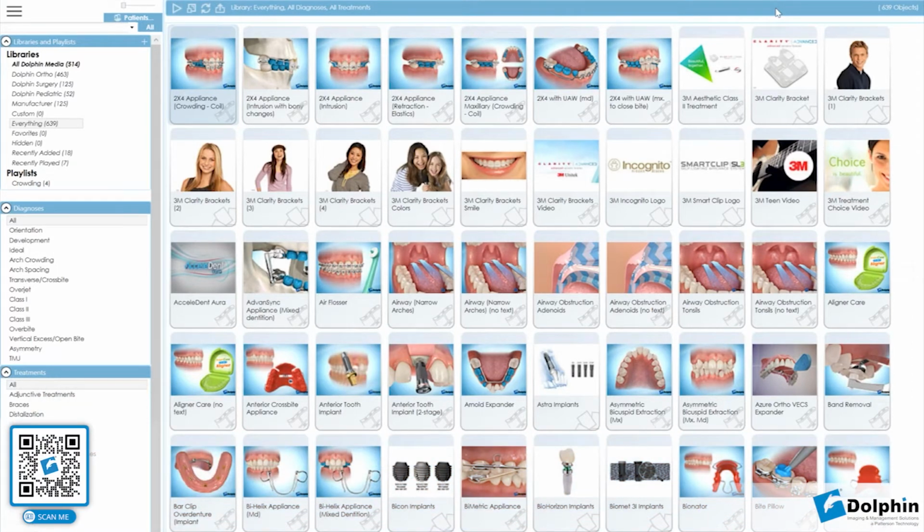And today we're going to be doing a little demo / lunch and learn on Dolphin Aquarium. I hope everybody enjoys this little presentation. It is going to be somewhere in the range of 30 minutes or so. The goal is to give you an overview of the Dolphin product, and also maybe learn a few tips and tricks if you are a current user of the product.